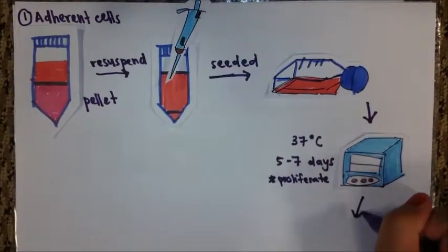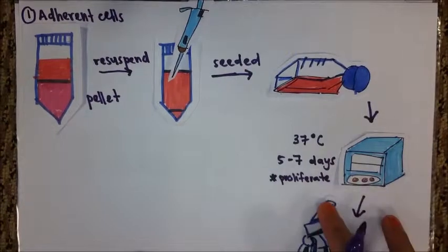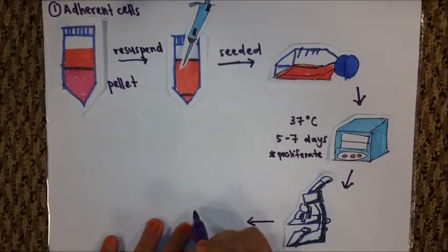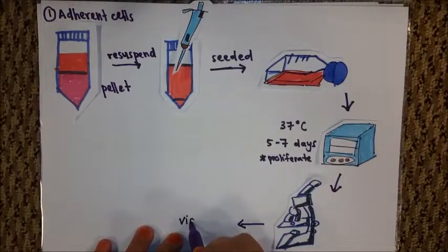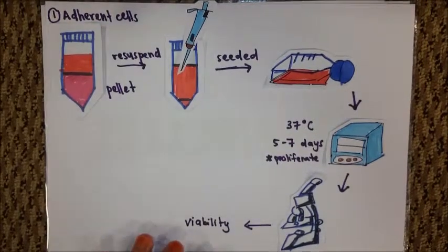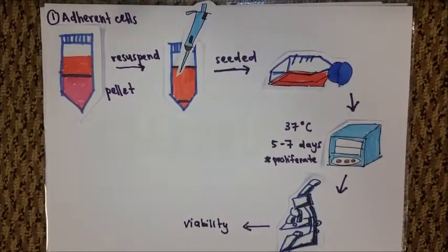After this, the condition of amniocytes of the primary culture can be assessed under the inverted microscope. Once the cells are cultured, they need constant maintenance such as changing medium and preventing toxic condition in the flask. Amniocytes morphology under the microscope could tell whether the cells cultured are healthy or not. The rounding up of the cells shows that the cells require new medium as the old medium has been used up.